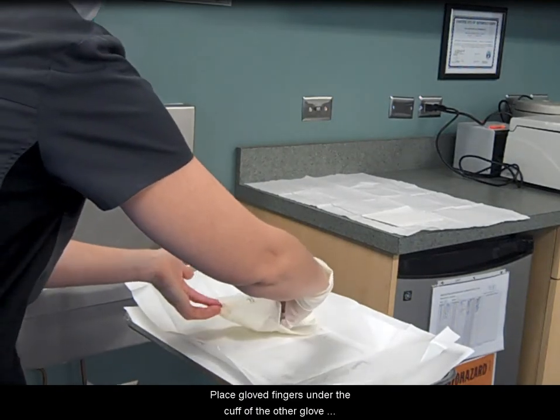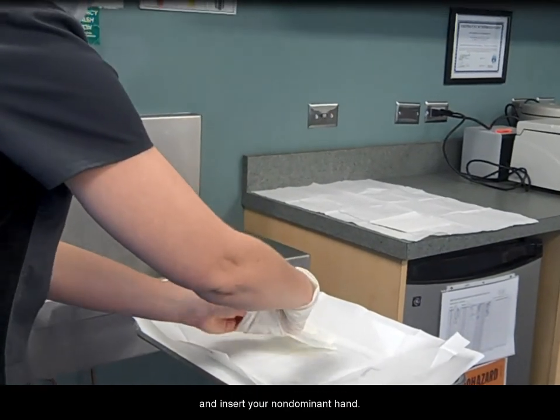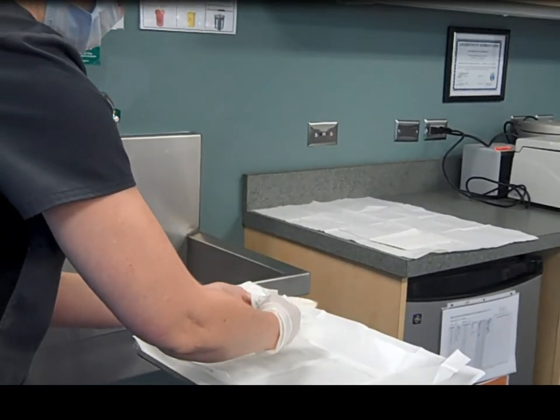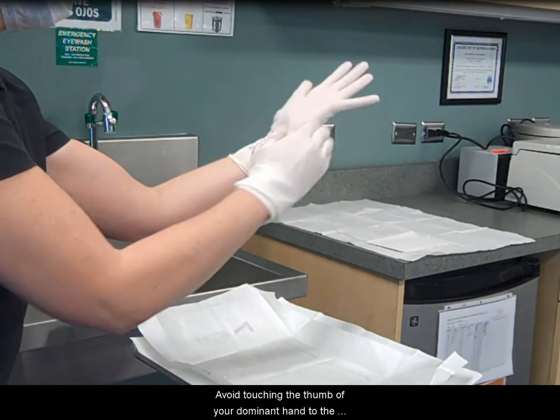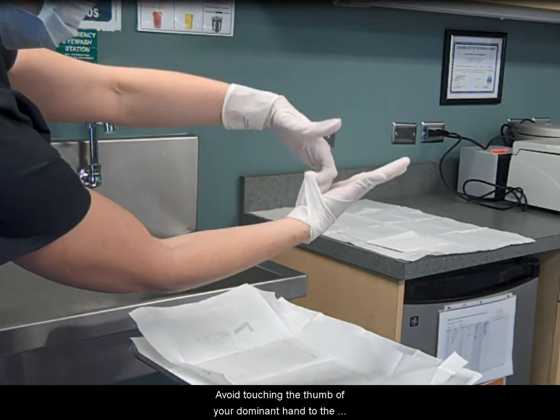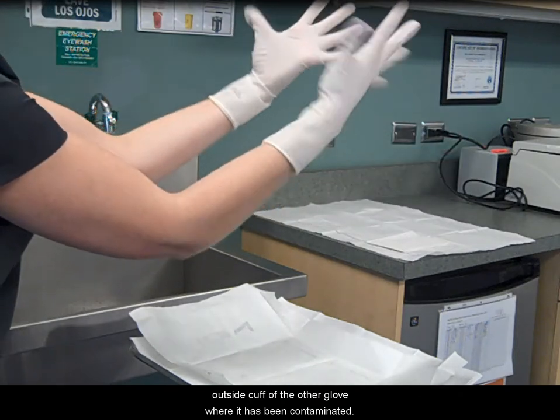Place gloved fingers under the cuff of the other glove and insert your non-dominant hand. Put the glove on by pulling on the inside fold of the cuff. Avoid touching the thumb of your dominant hand to the outside cuff of the other glove where it has been contaminated.